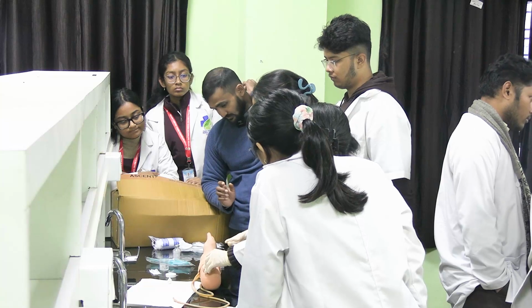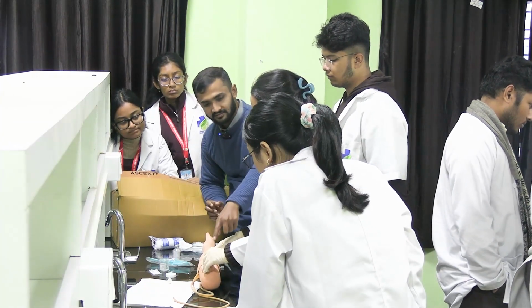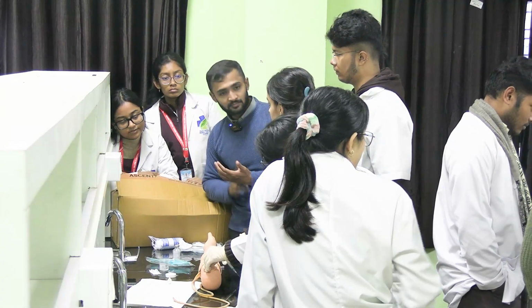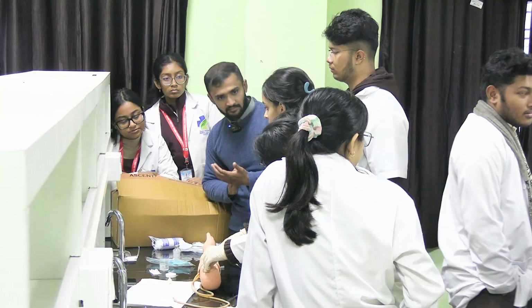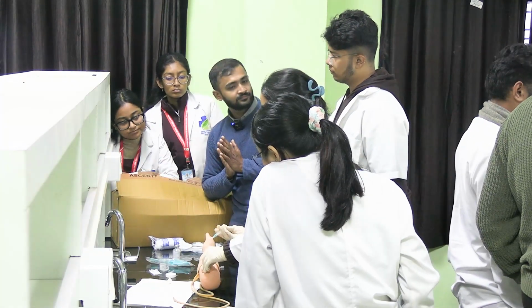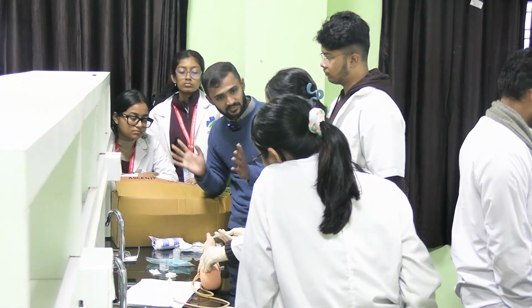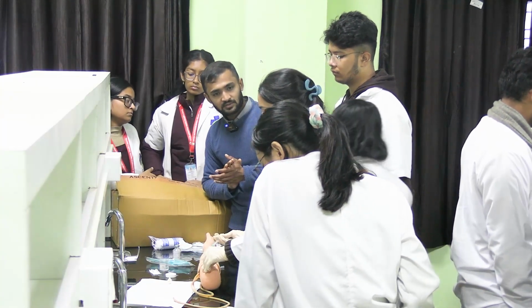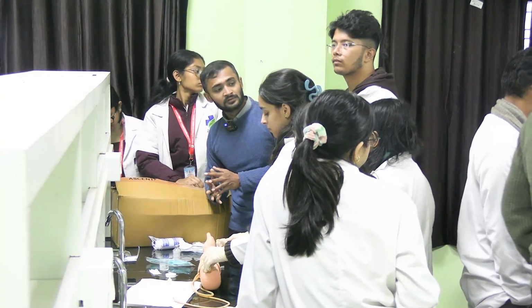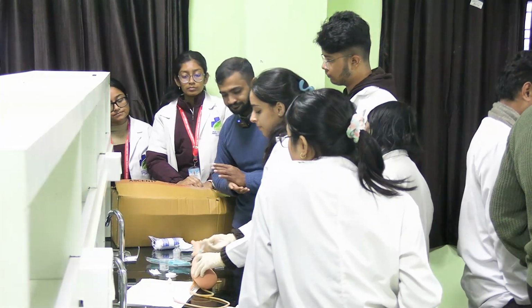Then, after removing the needle, you have to press the area for 1 minute. Then we have to wait 15 minutes to observe the patient for any adverse reaction. If there is no reaction, greet the patient, reassure the patient, and dispose of the waste according to biomedical waste management. Then the last step is hand washing. Then it is finished.